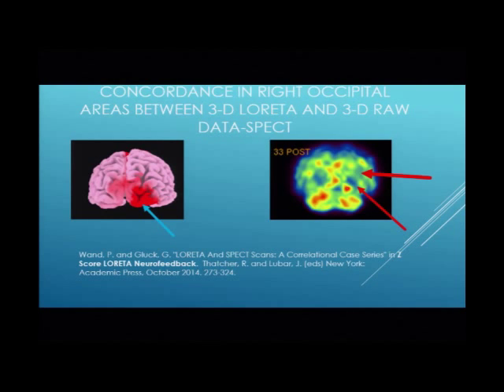Now here's a patient who was sitting in his apartment, and the ceiling fell on his head, and he got a head injury and a neck injury, and I don't know if the lawyer sent him to me or somebody did. So here's another view of the brain, and as it tells you, this is posterior. This is the SPECT scan because you see the flow and the colors. If you look very carefully, it looks pretty good. But if you look more carefully, you see big blue here, big blue there, and more blue there. So this is actually a little bit worse than that. And guess what? Once again, it matched the quantitative EEG. That can't be a coincidence. It's statistically impossible.